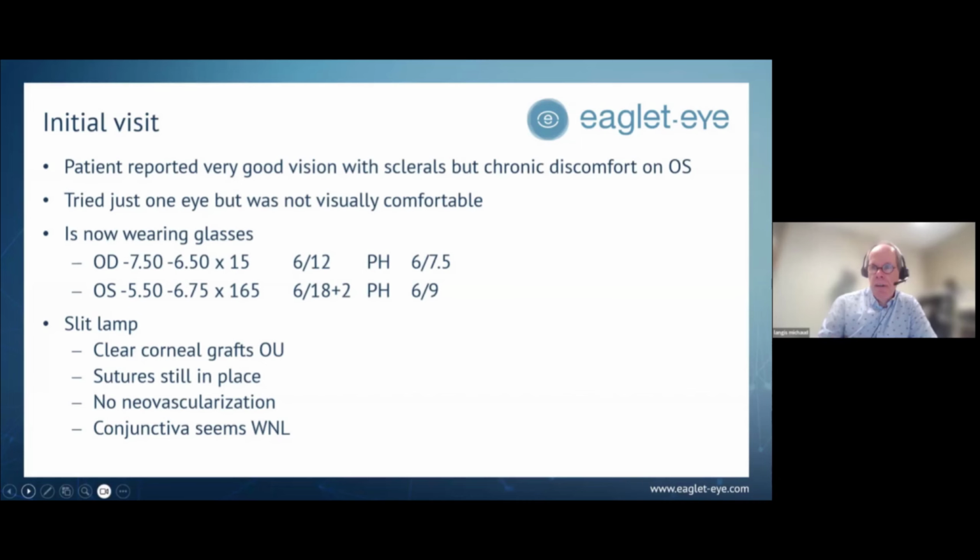So that's a good thing, because sometimes we deal with older patients with old grafts that are more fragile, and we know that scleral lenses may trigger hypoxia on a corneal graft, especially if the endothelial cell count is reduced to less than 800 cells, but depending on where the cells are and how viable the cells are. So the number is one thing, but you have to look at your endothelial mapping in order to identify the good cells from the bad cells and do the proper count out of that.